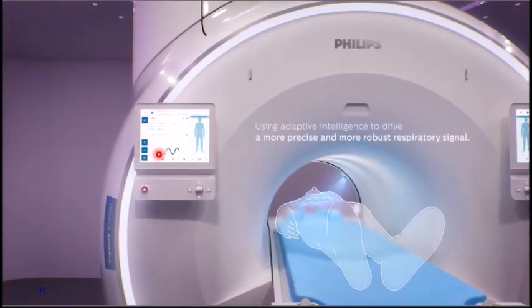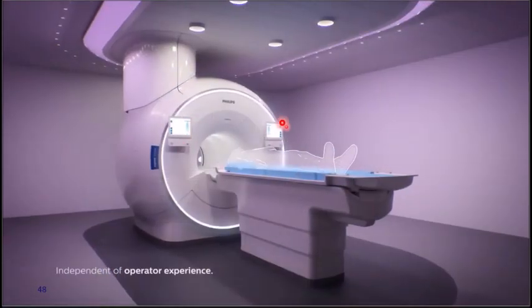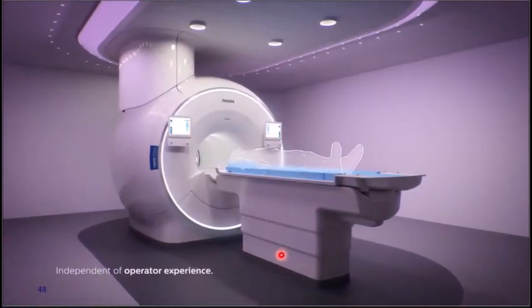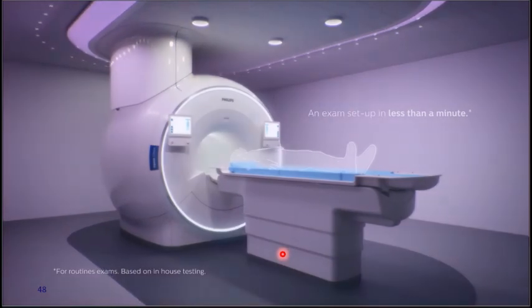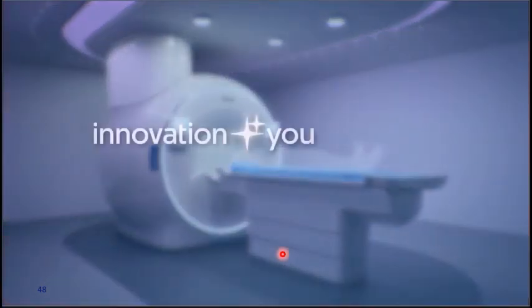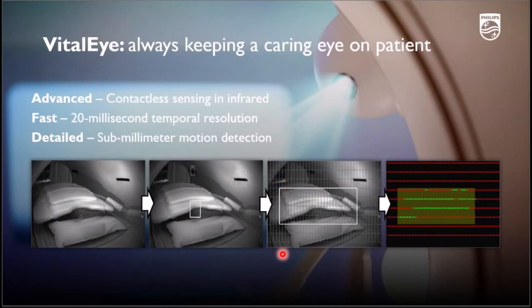The respiration signal is captured in real time, and the MR machine is synchronized with that. And here is a basic illustration of how it works.